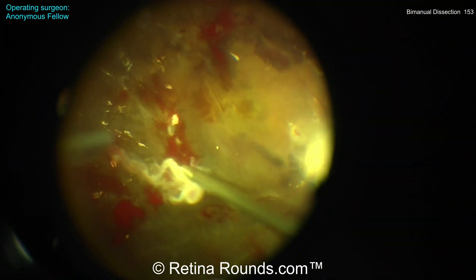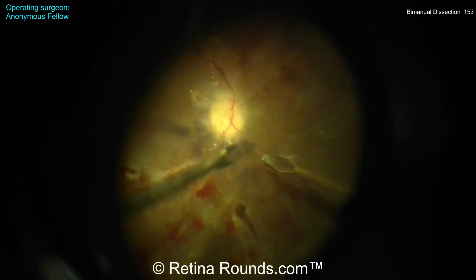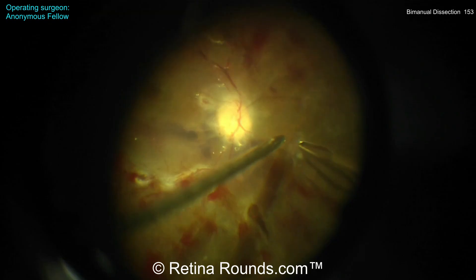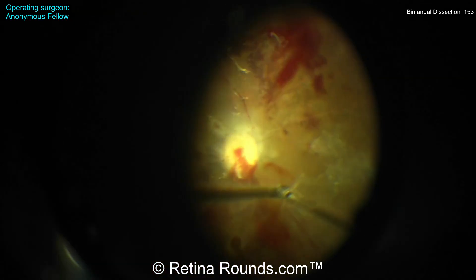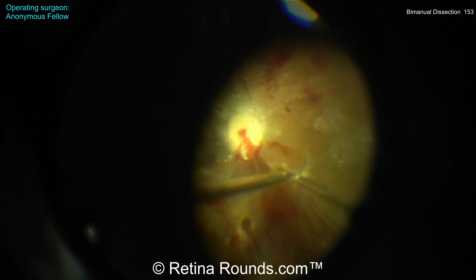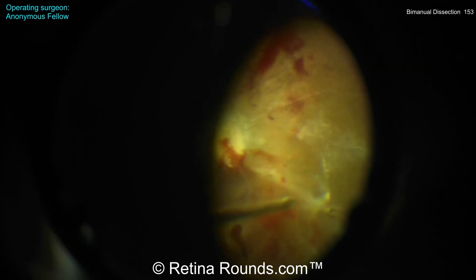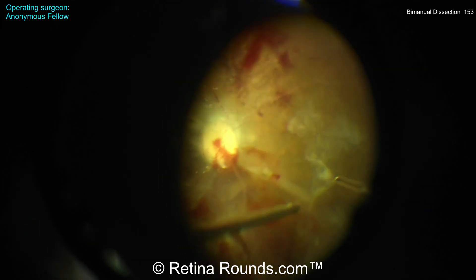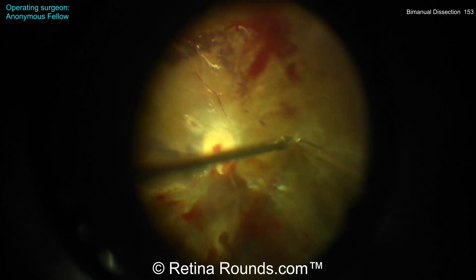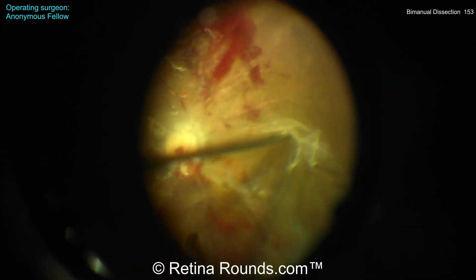That's very nicely done. You can see that membrane has been completely removed. It's removed now with a vitreous cutter and there are some residual hyaloid attachments nasally. You can see the surgeon pulling this membrane towards the nasal periphery, revealing that space, and then using the scissors to cut the fibrovascular pegs while the forceps are used to elevate up the residual hyaloid on the nasal aspect.